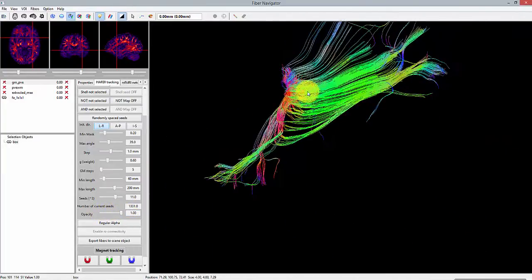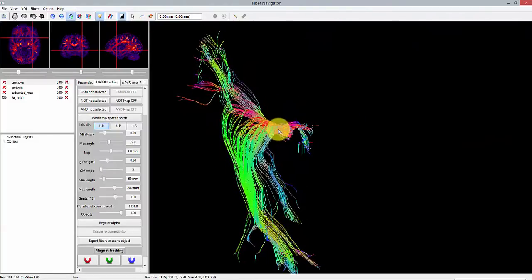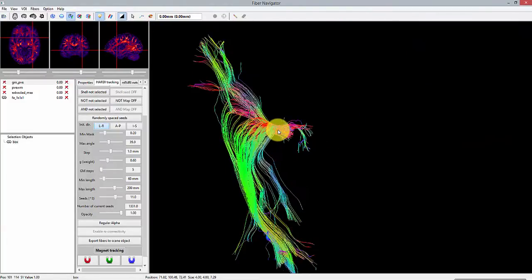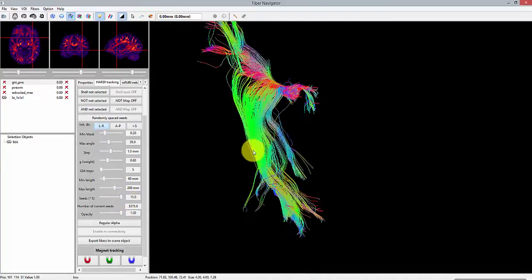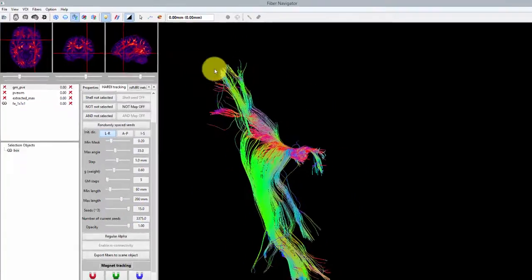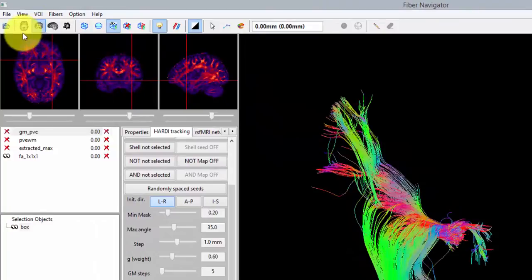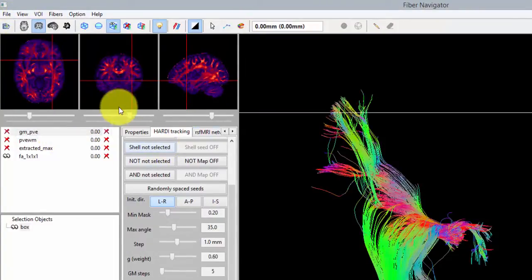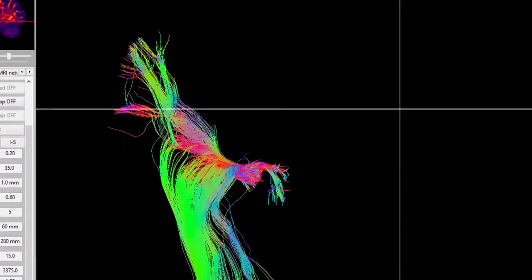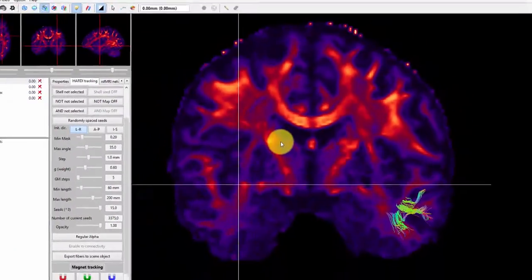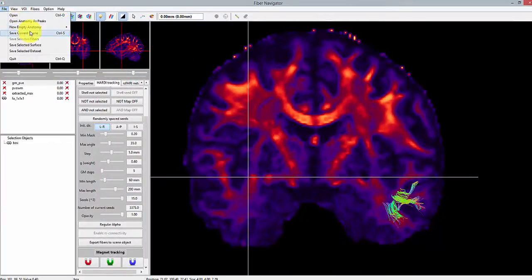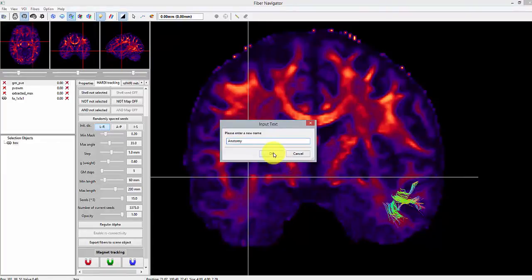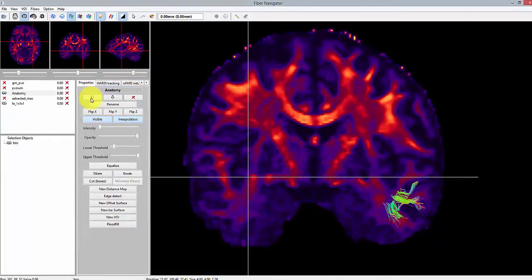As you can see, we have some undesired streamlines propagating towards the temporal pole, which we will take care of. There are actually many options to do this and I'm going to present two of them. The first one consists in eliminating these streamlines during the tracking process by giving an exclusion map to the algorithm. So here, I will be quickly drawing a region of interest that will remove any streamlines entering it.